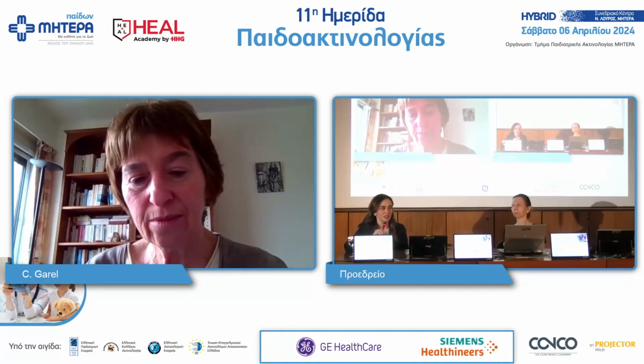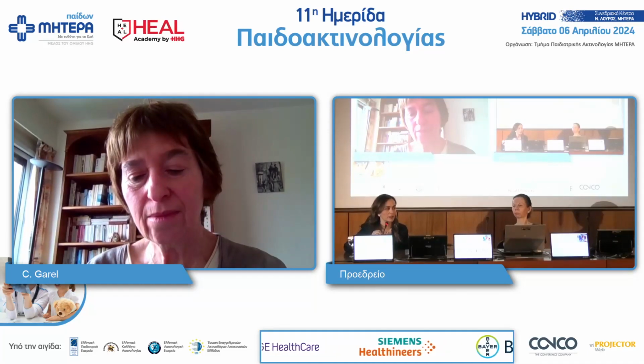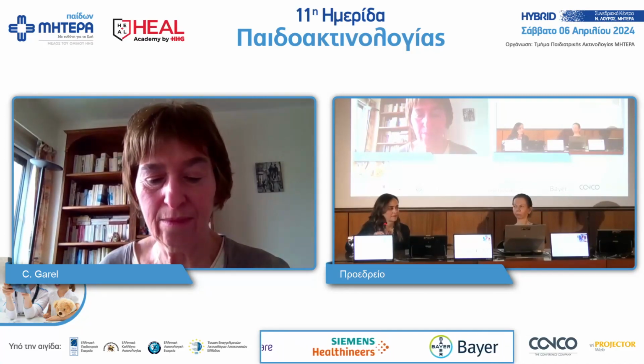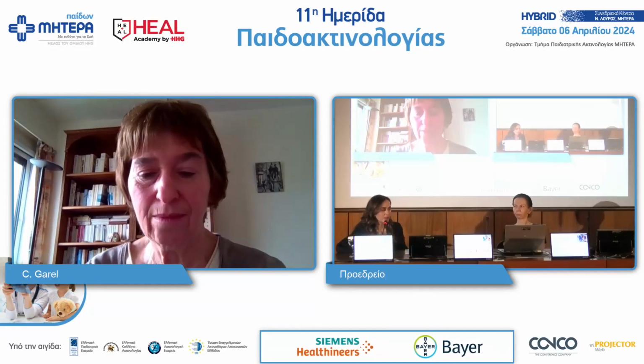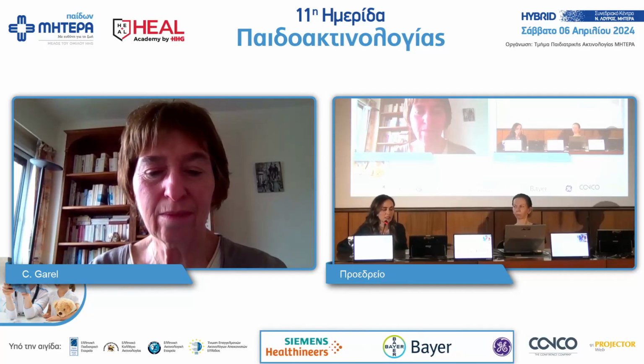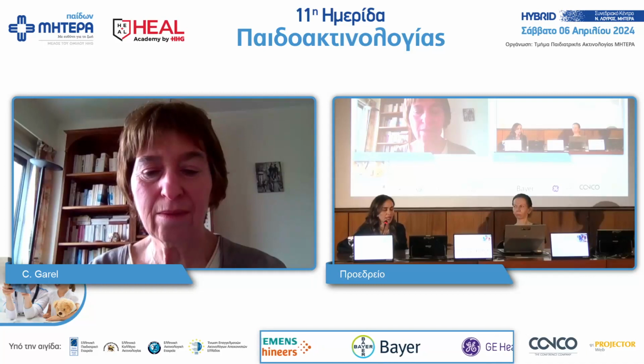Thank you very much. Are there any questions from the audience? We would like to encourage our online participants to send online questions. There is one question from the audience. What would you suggest as the optimal gestational age for fetal MRI when we are concerned for posterior fossa malformations?